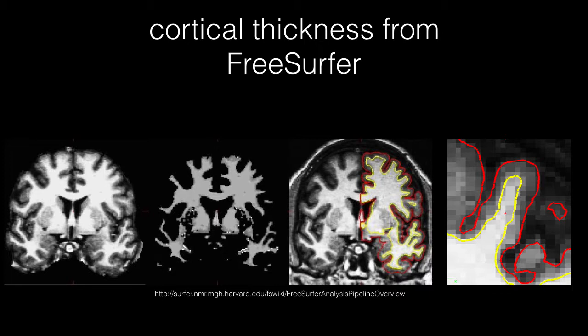If you take any point on that yellow-colored white matter surface, cortical thickness is just the distance between that point and the corresponding point on the red-colored gray matter surface. One of the things that's great about cortical thickness is that it's not just calculated as a summary value for an entire hemisphere or individual lobe or gyrus, the way that volume might be.